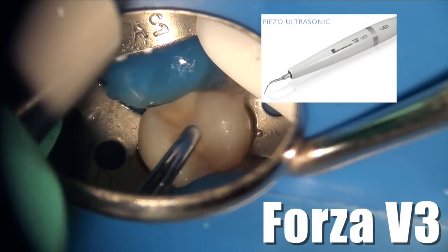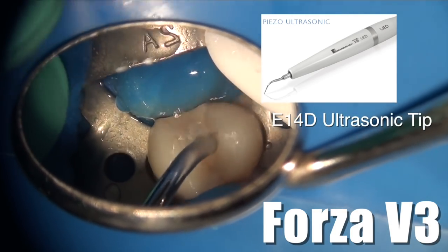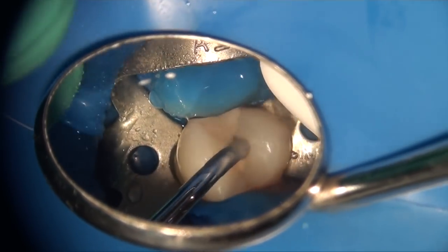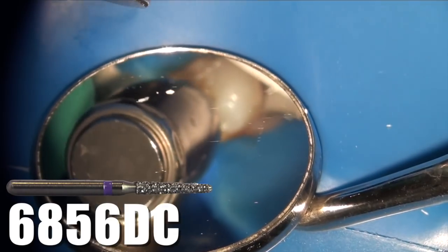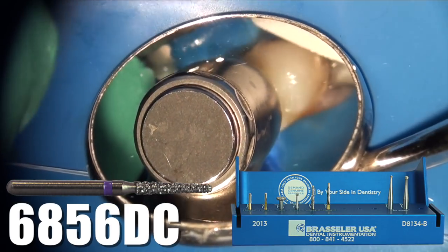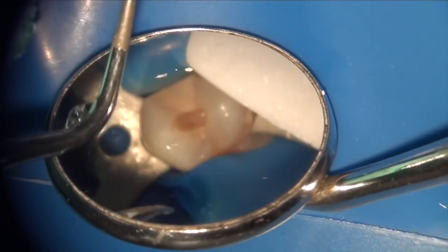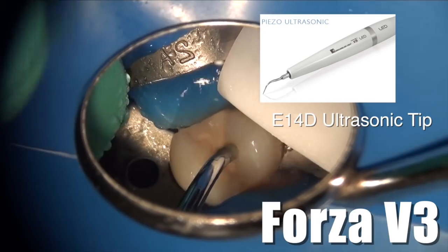After the outline form is created, I'm using my Forza V3 ultrasonic piezoelectric with an E14D tip, which is a diamond-coated ultrasonic tip. The goal is to make everything blend in together from the roof of the pulp chamber to the walls into the orifices. For more efficiency, you may want to use a 6856 DuraCut bur, which is a rotary bur with diamond-coated DuraCut technology — it can cut aggressively and create the shape you want. Then use the Forza V3 diamond-coated tip to make sure everything is blending in.